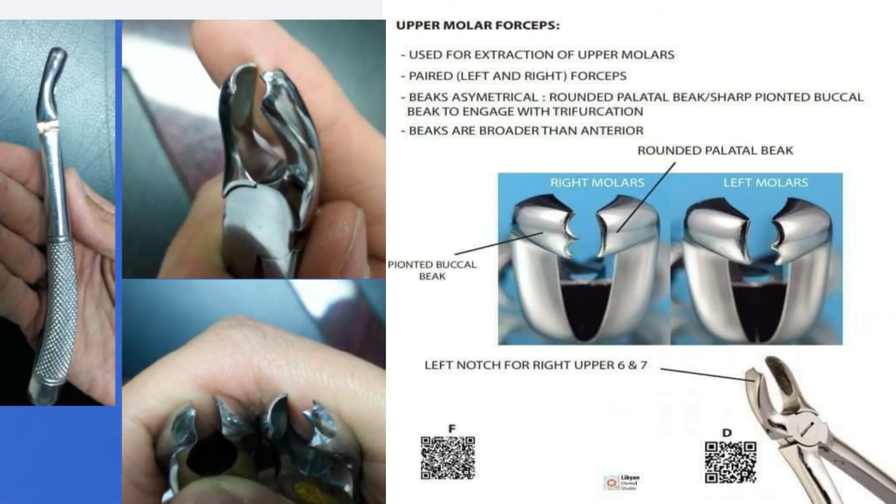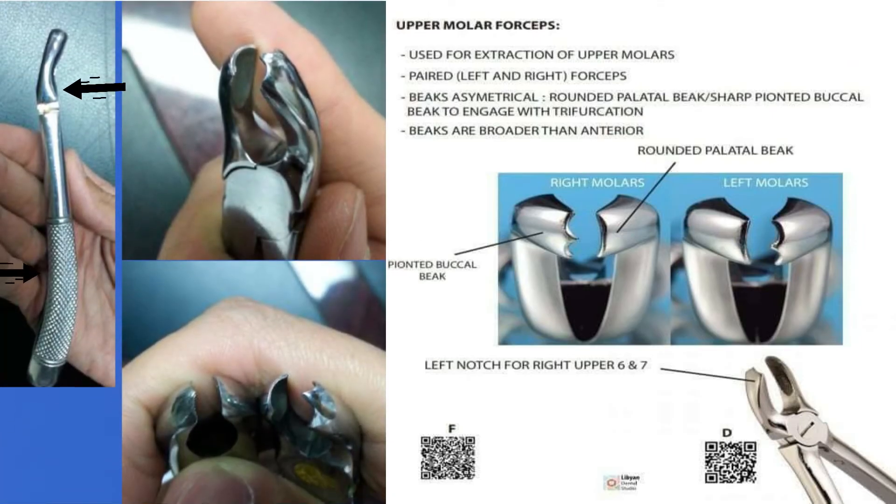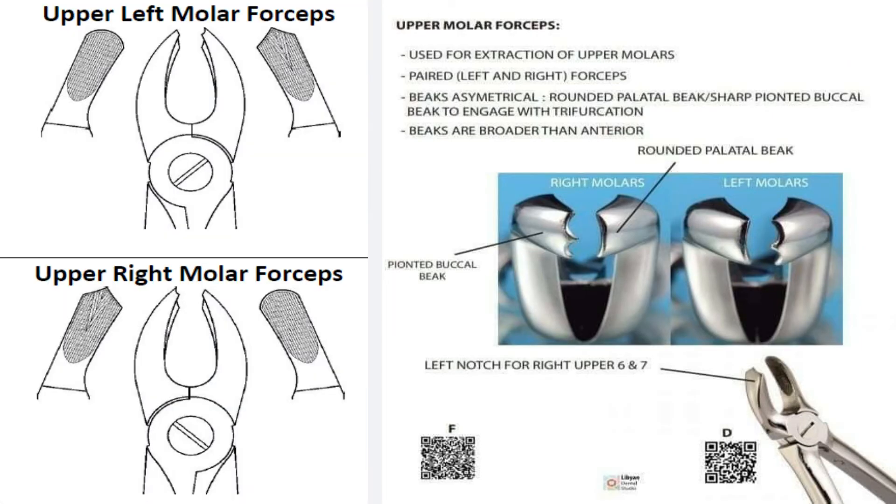Upper molars forceps. It also has two bends. The palatal blade is round and the buccal blade has a projection or arrowhead to fit the root furcation on the buccal side of the molar. There are two forceps — one for the right upper molars and one for the left upper molars.